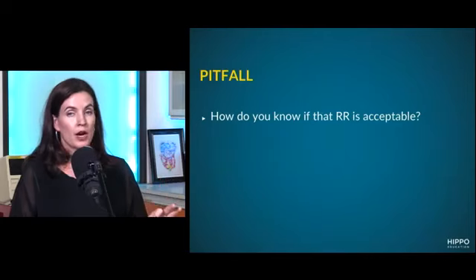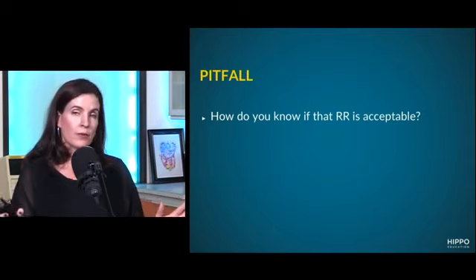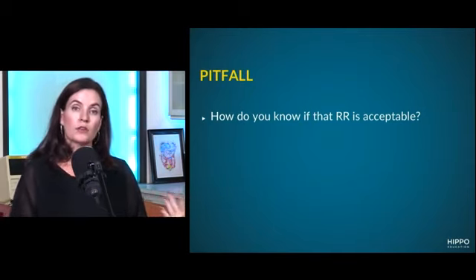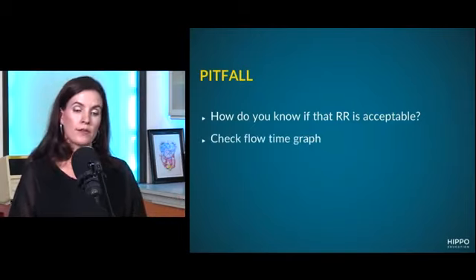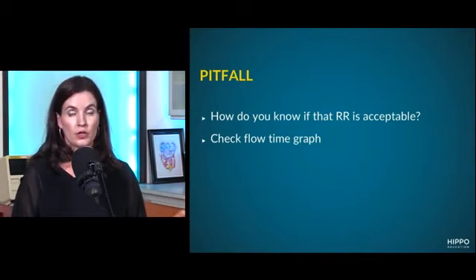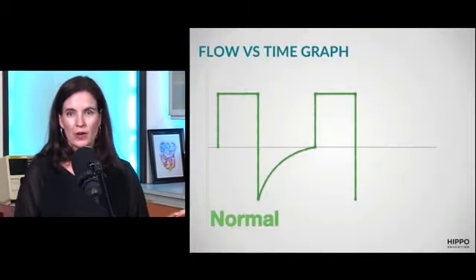And so while I start at 10, you want to be careful to decide that that rate is actually the acceptable number for these people, because you don't want them too low or too high. And so when I'm at the bedside, I will check a flow time graph, and I'm going to show you just the basics of this graph, but your RT can display it for you on the ventilator, and it's going to give you breath-to-breath information. So this is a bit of an advanced concept. Stay with me here, but I think we can all master this.